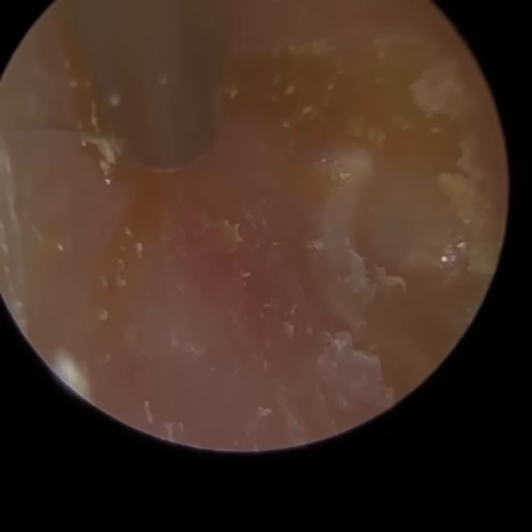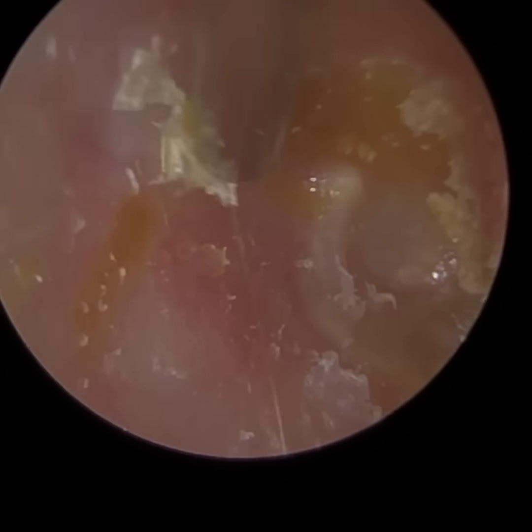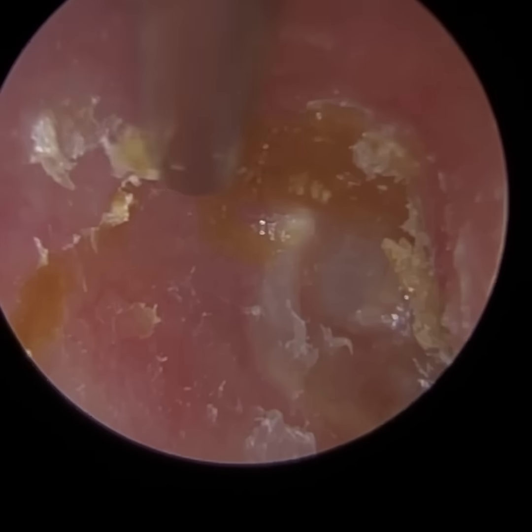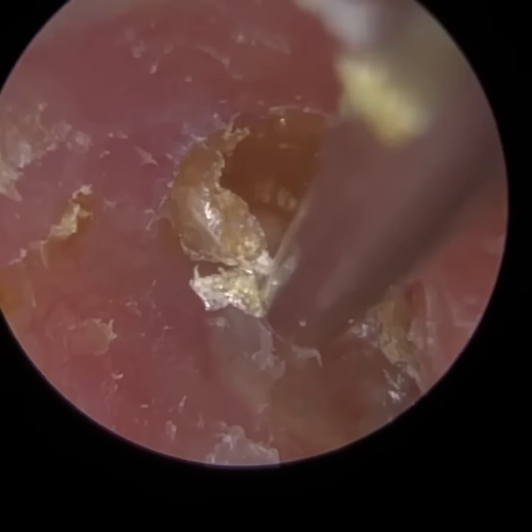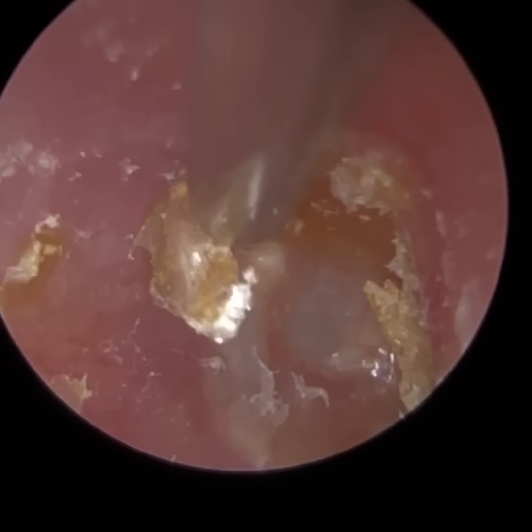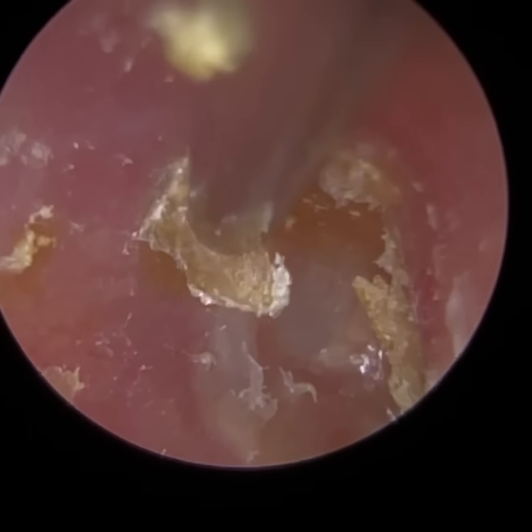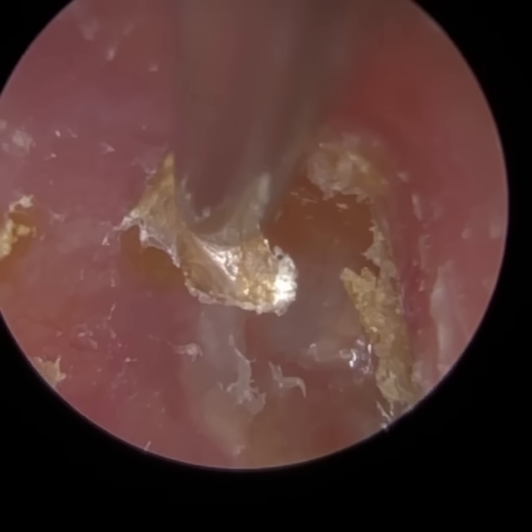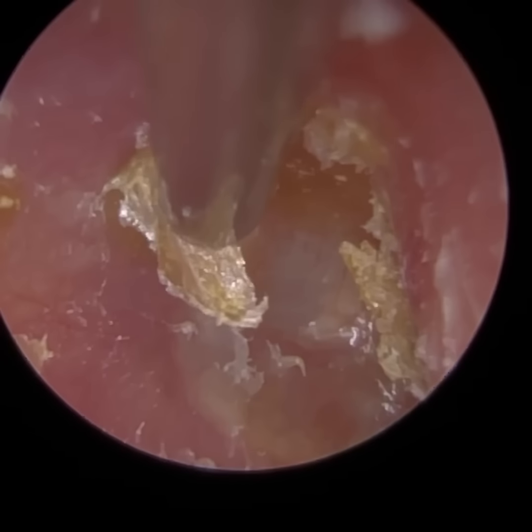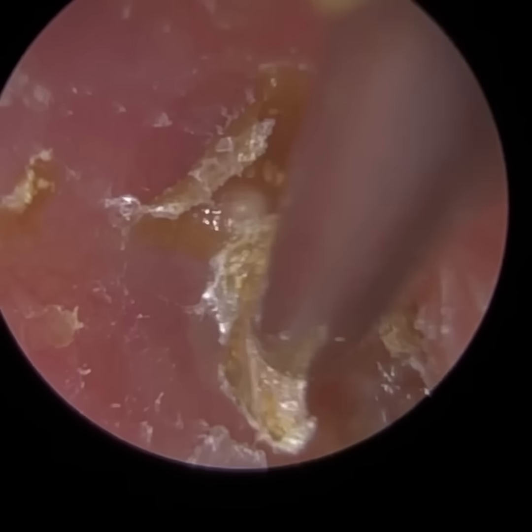Now, in this particular case, I've got a feeling it's to do with the ear anatomy. I mentioned at the beginning, we know they've got a history of mastoiditis, and it may not be related to that, but you'll see it right at the end as well. I'm going to do some annotations. The back part of the ear canal, you may see it yourself here, near the eardrum, we call that the posterior, so the back part, medial towards the eardrum.